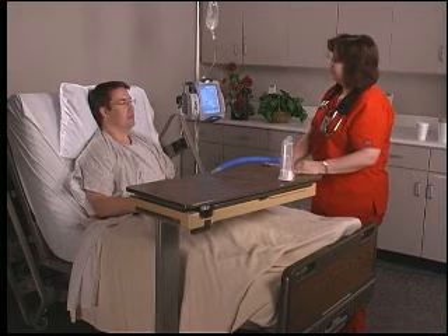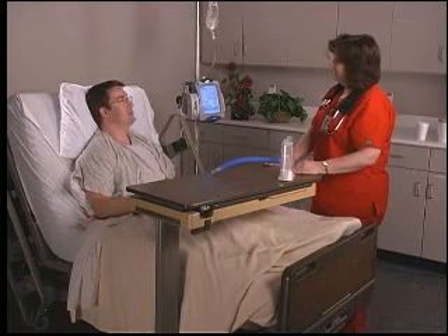Do you have any questions for me about how to use the incentive spirometer? No, pretty straightforward. All right, I'm going to have you try it.